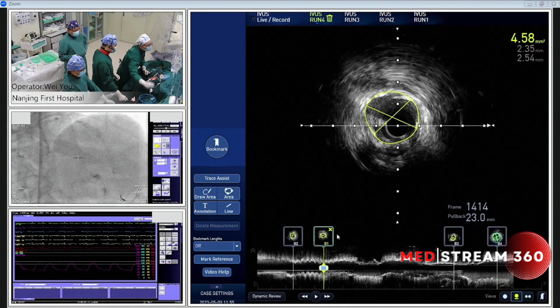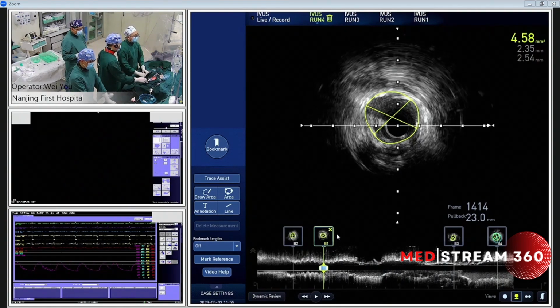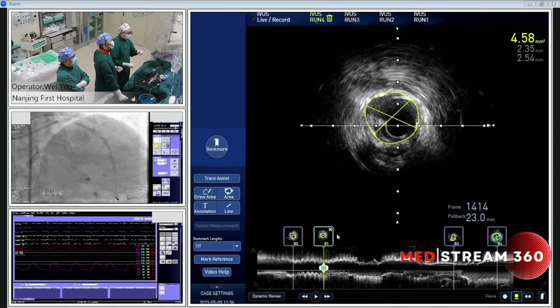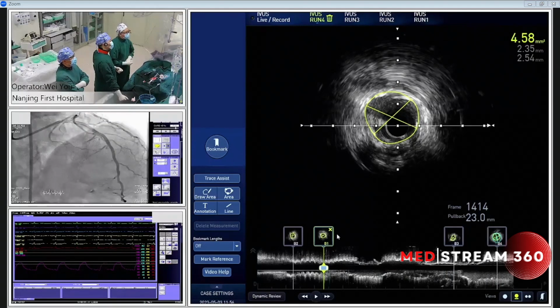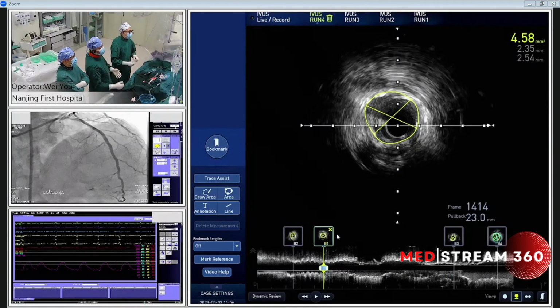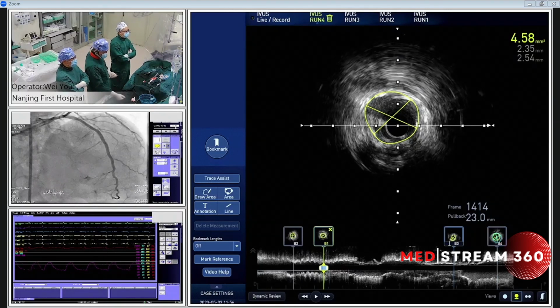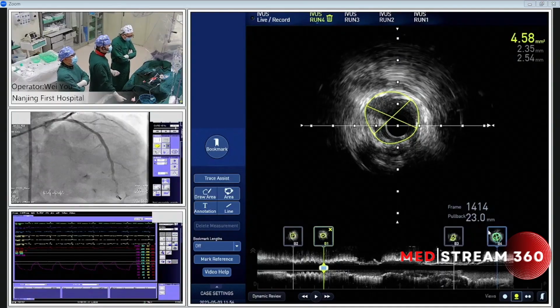Dr. Yu, can you give some summary for this case? For the severe calcified lesions, lesion preparation seems very important before DES implantation. That's why for today's case, we used a modified rotablation, with the 1.5 burr, to easily let the IVL balloon pass through. IVL seems safer compared with rotablation using a big size burr. You can see the final results just meet the 3 criteria of the ULTIMATE criteria. I think we can finish the case. Thank you all. Thank you very much.